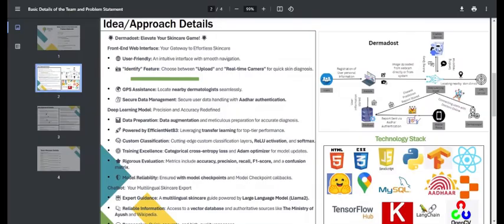Now let's talk about the working of our application. Starting from the front end, we have created a very user-friendly interface. Future plans for the front end include a real-time camera feature where the user can use their webcam for live video detection, and GPS assistance to help you contact nearby dermatologists based on your location.